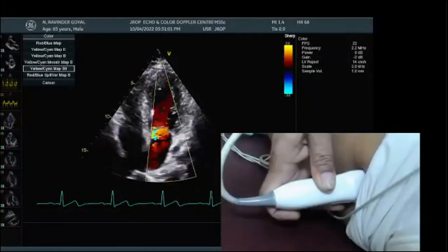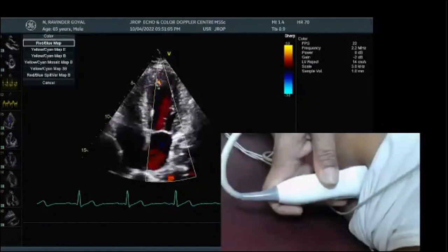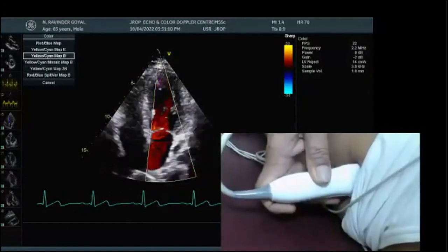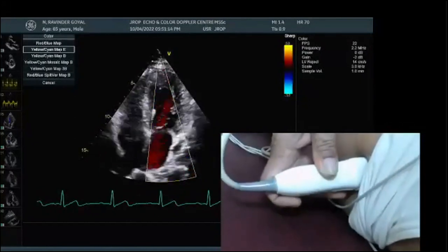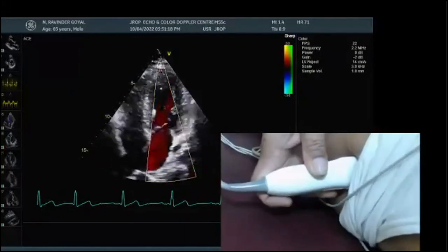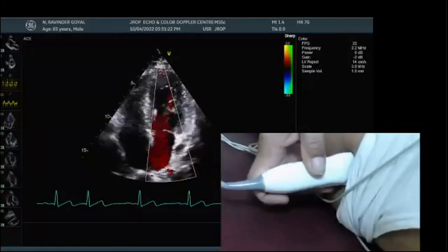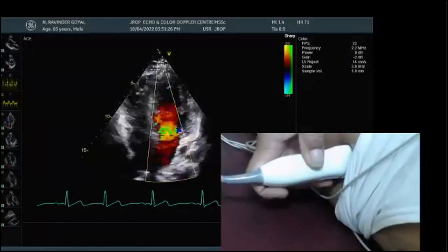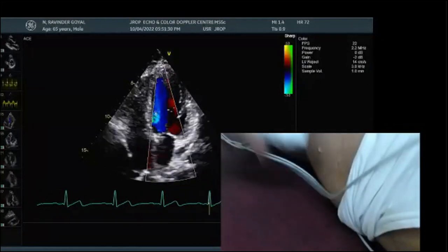These are multiple maps which you can see on the screen. But we will use a variance color map for day-to-day practice. You can use any one. It depends on which eyes you are tuned to. I'm tuned to my variance map. The majority of people are tuned to red and blue maps. Right, Jigna? Yes, sir.